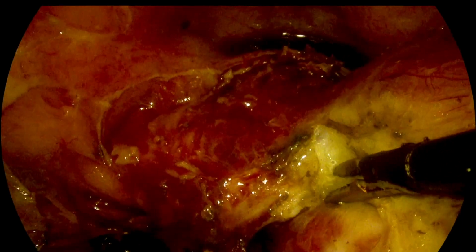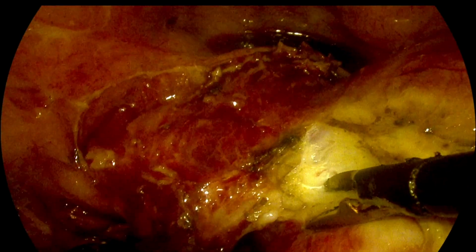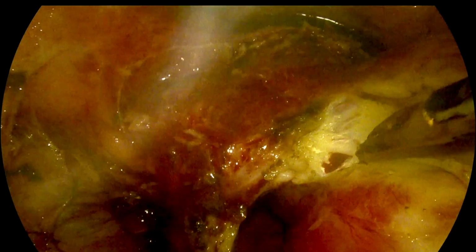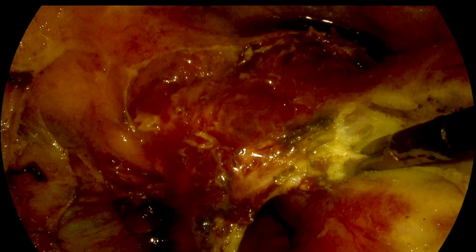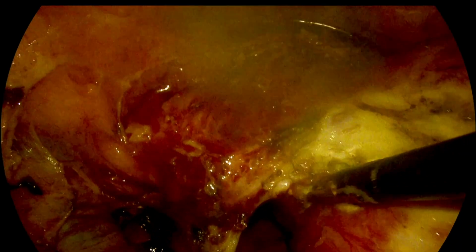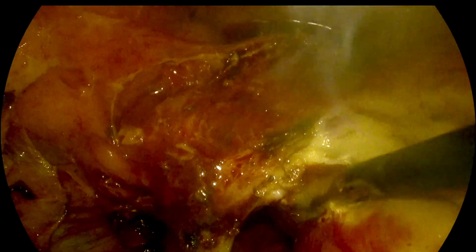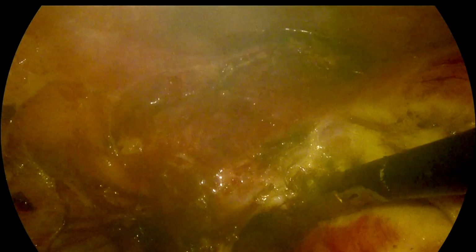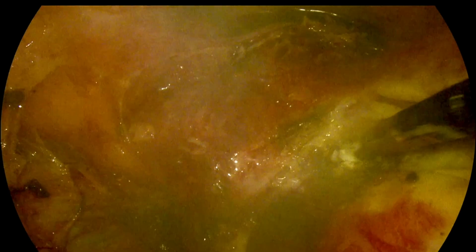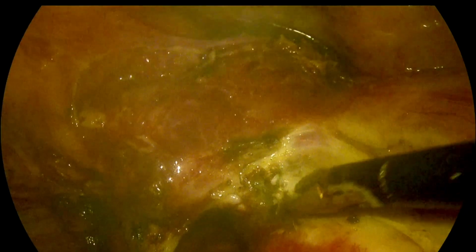Otherwise, it takes more time or more bleeding will happen if you try to seal them after they start bleeding. You can see even after sealing them, they are going to bleed. So better to identify them, seal them completely, seal the adjacent vein as well, and then divide using the shearers. So that is the uterine artery that will be divided.